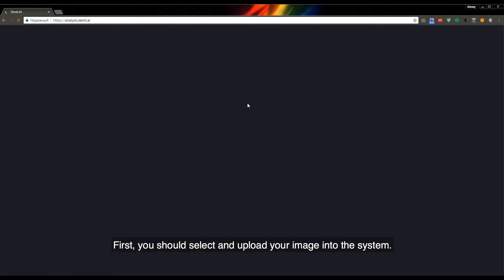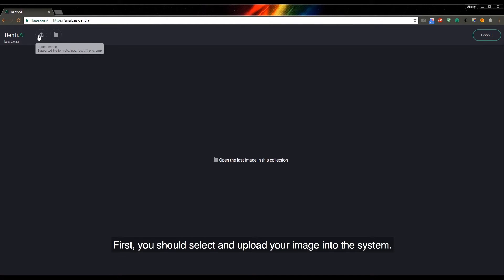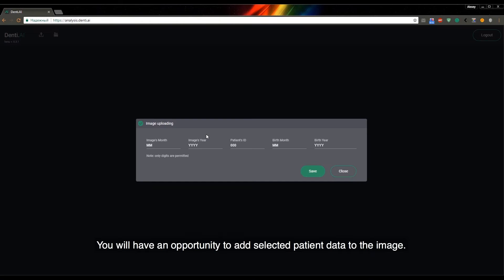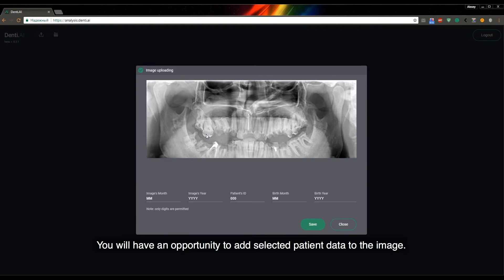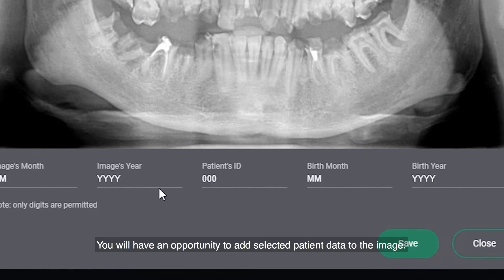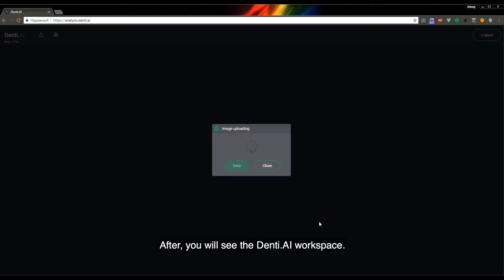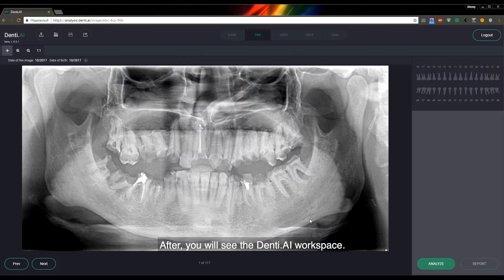First, you should select and upload your image into the system. You will have an opportunity to add selected patient data to the image. After, you will see the Denti AI workspace.